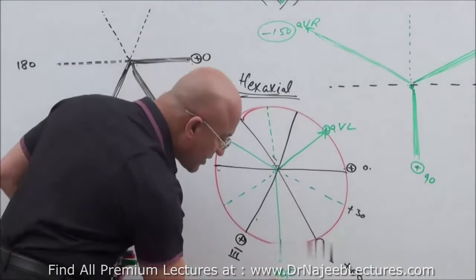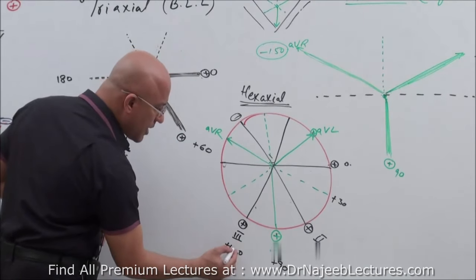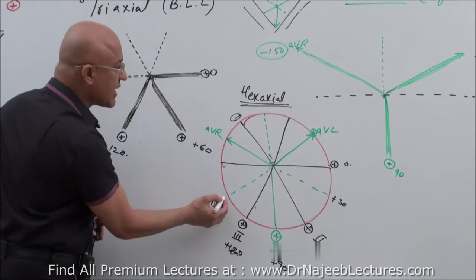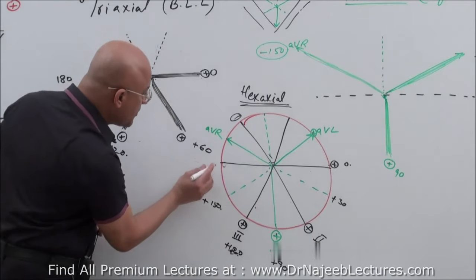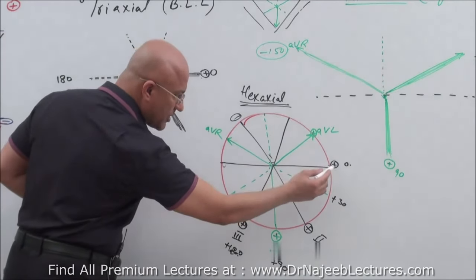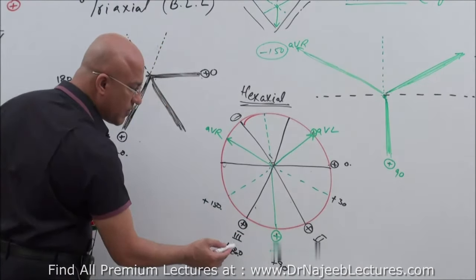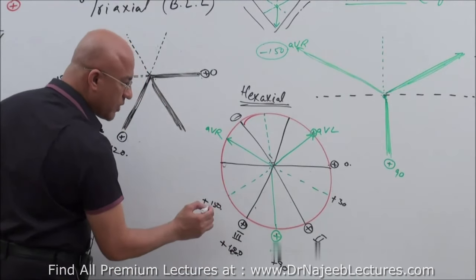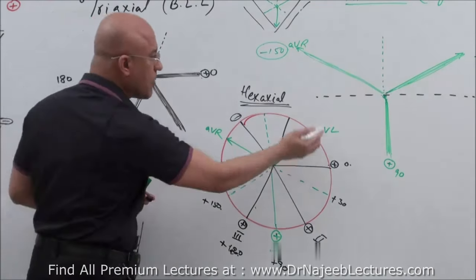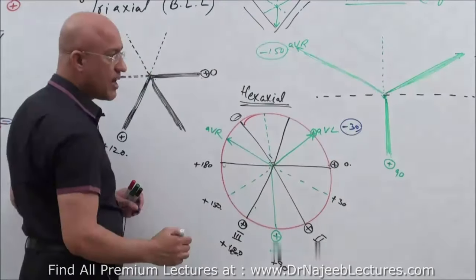Lead number two. Then plus 90 AVF. Then plus 120 lead number 3. At plus 150, there is no positive here. It's only a negative end or indifferent end. And if you reach from here up to here, you're moving from 0, plus 30, plus 60, lead number 2, plus 90, AVF, plus 120, lead number 3, plus 150, there's no lead, and then this is plus 180 along this. Now you move upward. This is minus 30, this is the orientation of AVL.